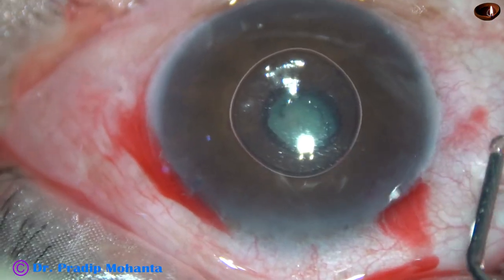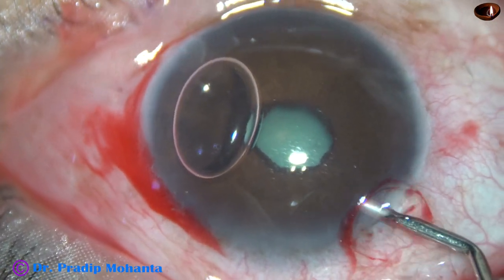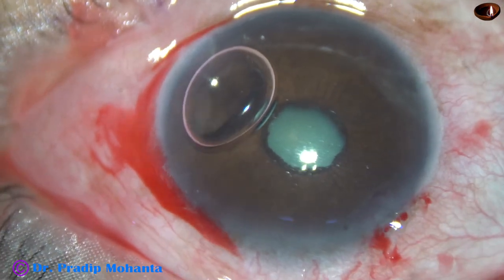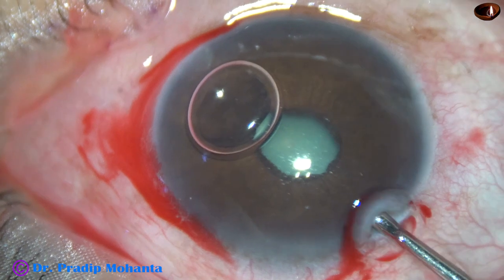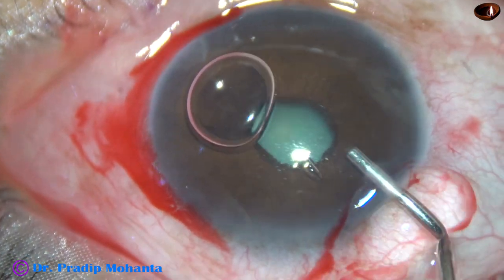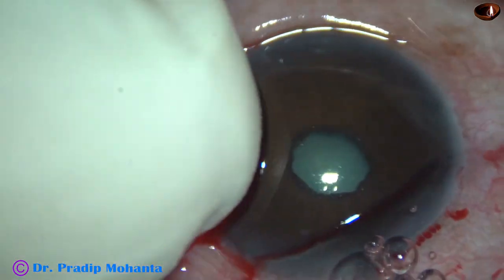My plan was to stain the anterior capsule underneath this air bubble, but that is not possible. If I inject trypan blue dye, most of the peripheral part of the cornea will be stained. So I have changed my plan.